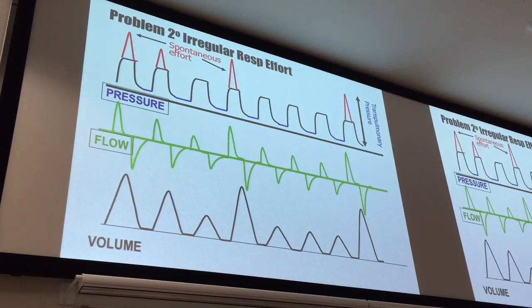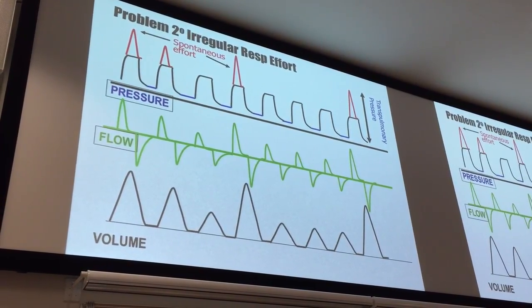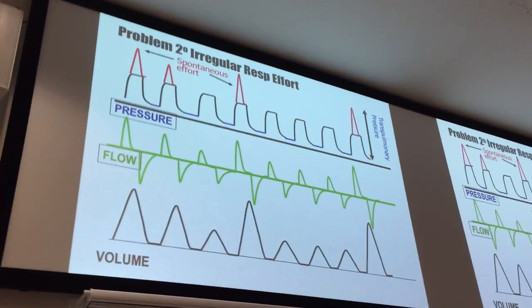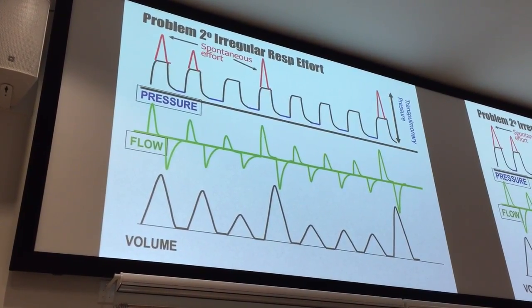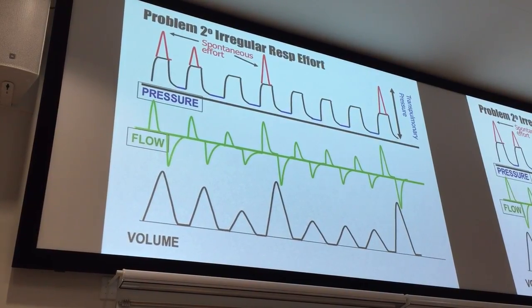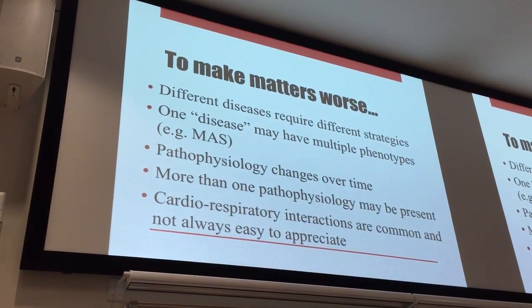And that's what happens with synchronized ventilation, in this case obviously an SIMV or assist control where the baby goes apneic, right? So babies do not have a reliable respiratory drive. So they pause in their breathing, and their tidal volume does fluctuate all over the place. And that's the nature of the beast, but you need to understand these interactions if you're going to make sense of what's going on with your baby.